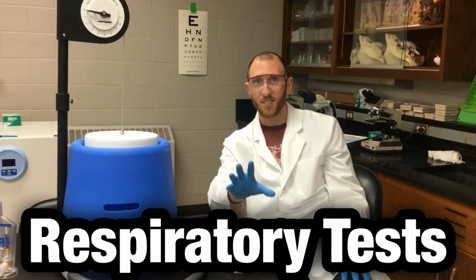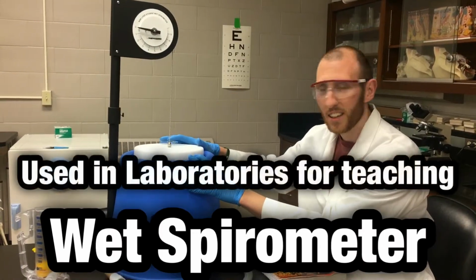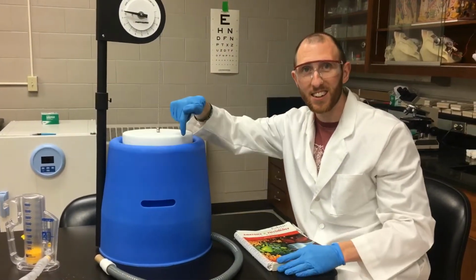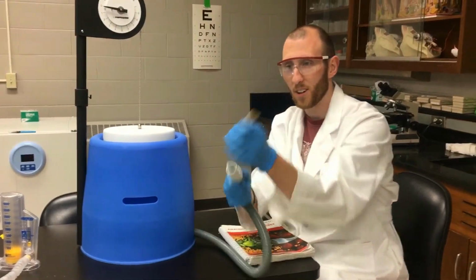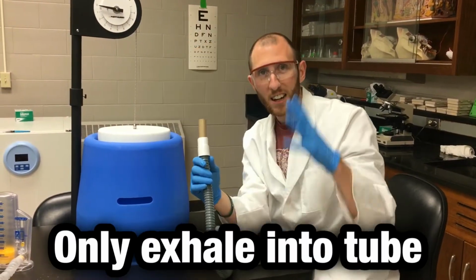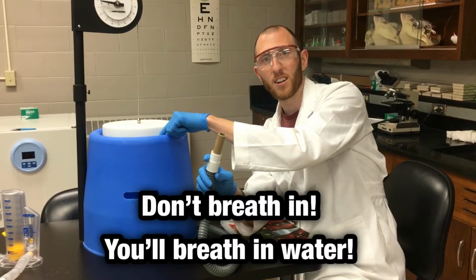So first off, the thing you gotta know is this is a wet spirometer machine. And what that means is it's wet, there's water inside of here. And with a wet spirometer, once you've got this piece of cardboard in the tube, you're gonna actually exhale or expire into this tube. If you breathe in this tube, you'll breathe in the water.